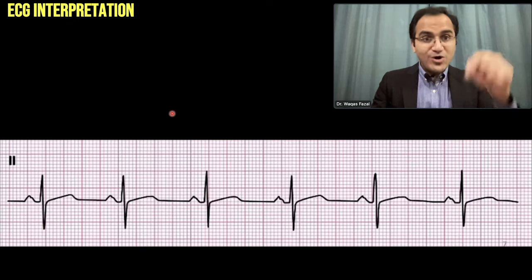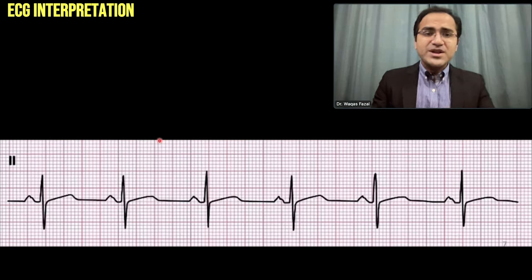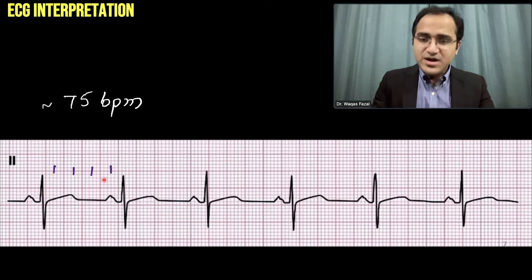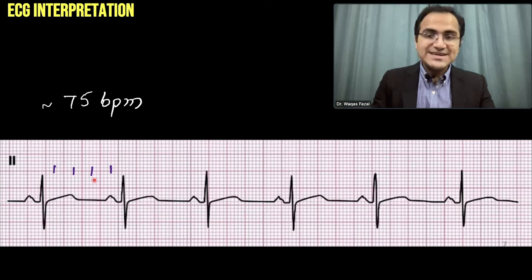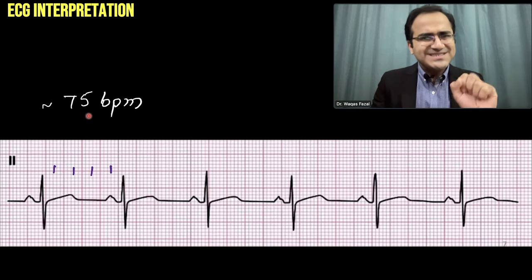Pause the video and solve this ECG yourself. For the answer: counting the large squares — one, two, three, four — giving 300, 150, 100, 75. So the rate of this rhythm is approximately 75 beats per minute.